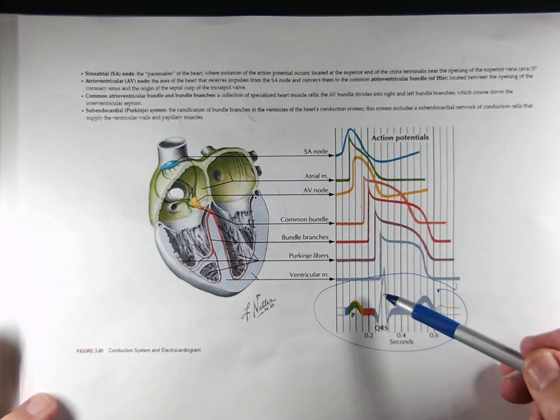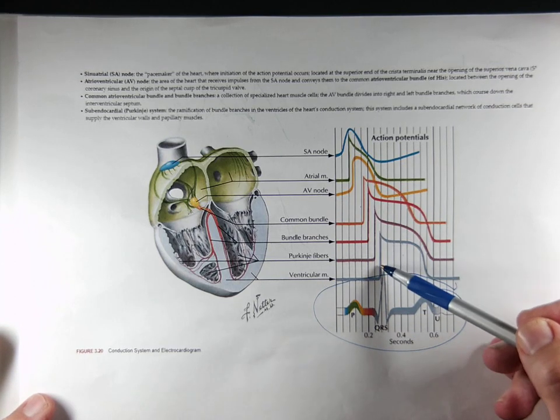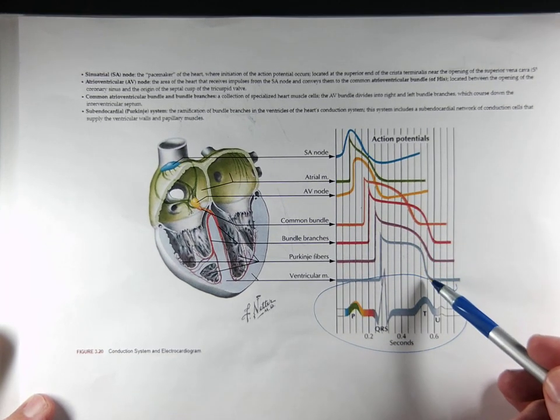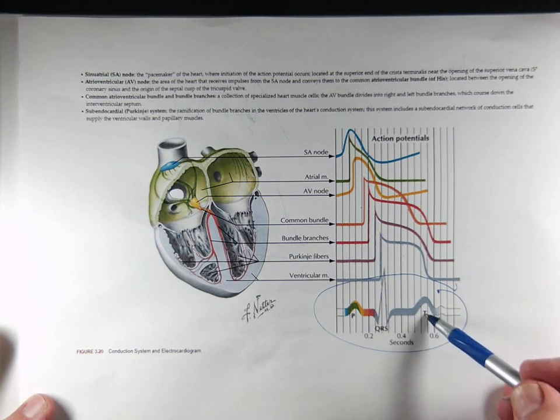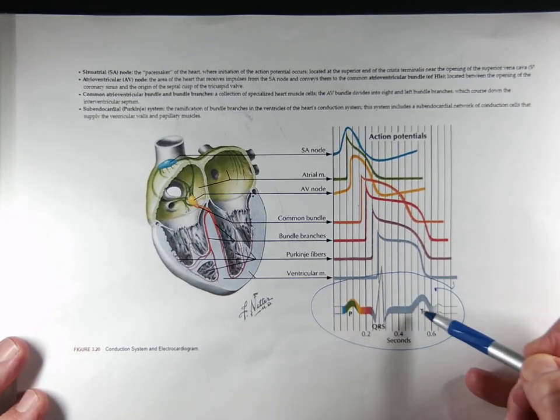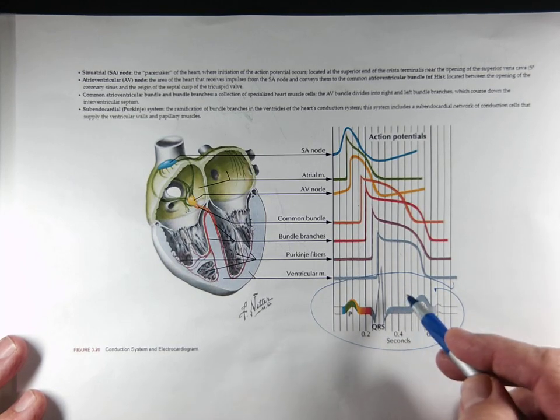Okay? And remember, the QRS is really the depolarization, which is mostly occurring during this phase with sodium channels, a little bit of calcium. And the rest of the action potential is where we're starting to repolarize again, which is where our ST and T wave are. So the QRS is very narrow, just correlating to this first part of the action potential, and the ST and T wave are correlating with the rest of this. Taking all these together, we can read those. Now, how do we read them, and why do the leads look the way they do?